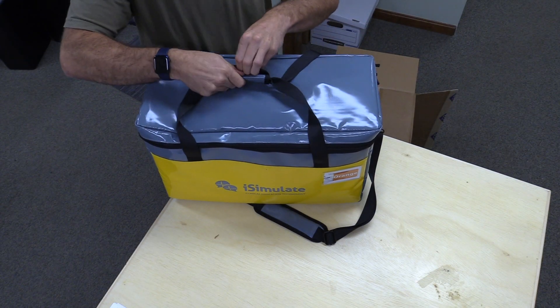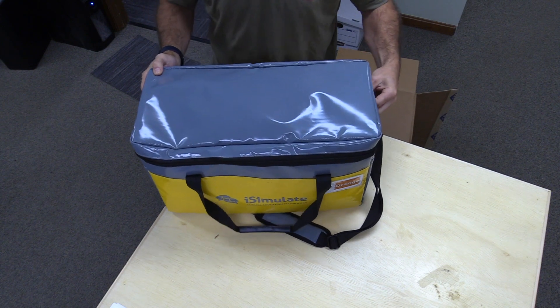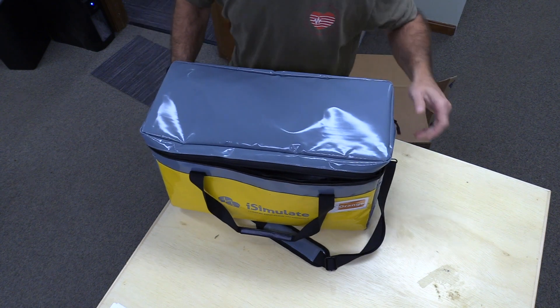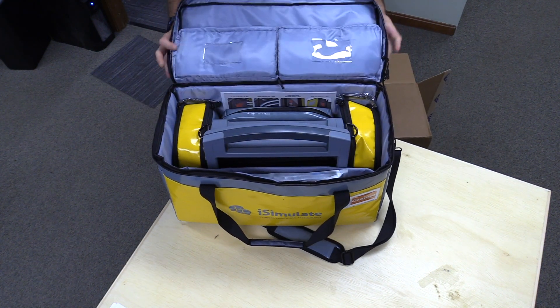Once you get your kit out of the box, let's go ahead and open the bag and take a look at some of the pieces and parts included in the kit. There may be some variation depending on the modules and options you've ordered, but we'll try and cover the majority of them here in this video.